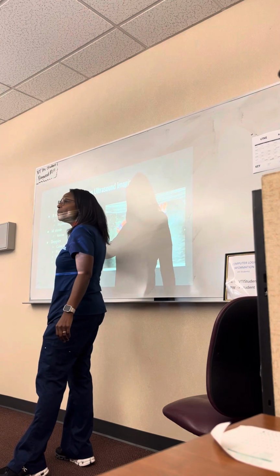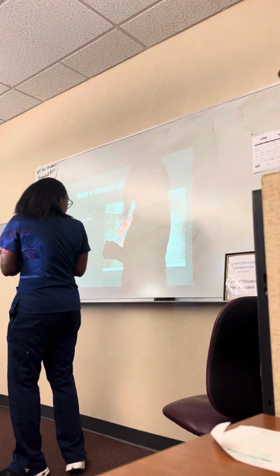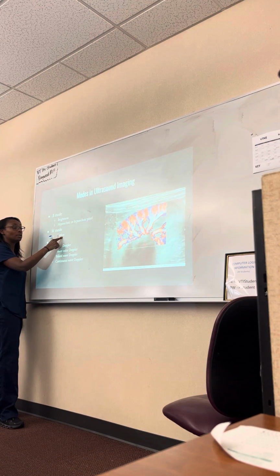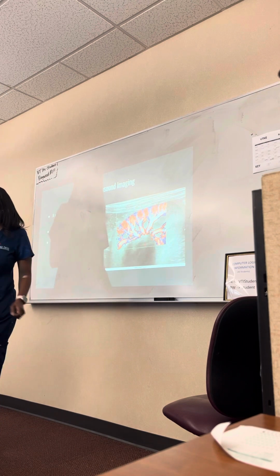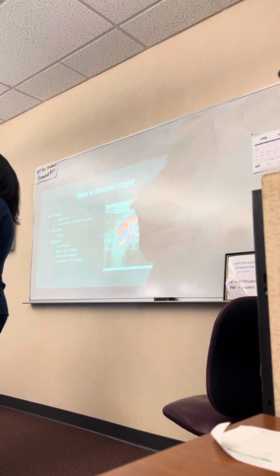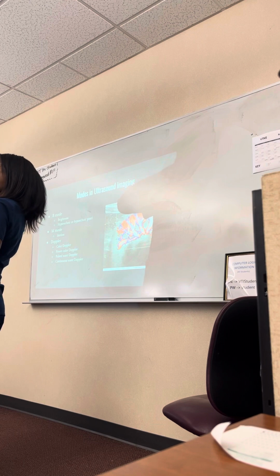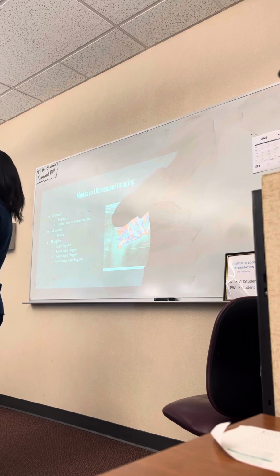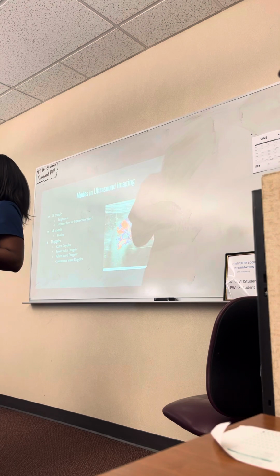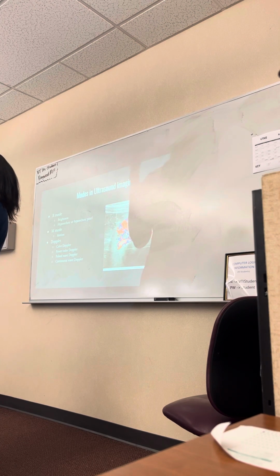Okay. So my M mode is for something that I'm taking ultrasound of that is actually moving. So think of M for motion. M mode is motion mode. And so oftentimes that mode is going to be used for cardiac studies, right? The heart is constantly beating. So they could come in, they could put the probe directly over the heart and look for stuff, or to get a really good visual, they can do what is called an echocardiogram, where they put the probe down the esophagus, and they can actually watch the heart and look at the different valves and things like that, right?